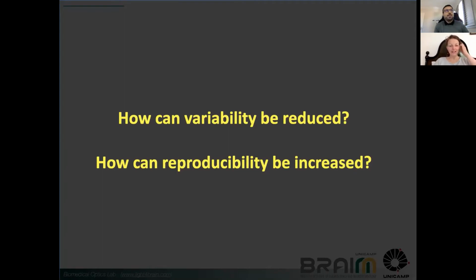Thank you. And the second question, also about the intra-subject variability, something you did talk about, is to what extent it is due to the time of day or maybe the setup of the NIRS device itself? Yeah, so I guess it's related to both, right? I don't know what you mean by the setup. There are a lot of things related to the setup, from the instrumentation itself to the probe positioning, right? So what we realized is that the time of day can play a role, and mainly because of this systemic physiology that changes over the course of the day.